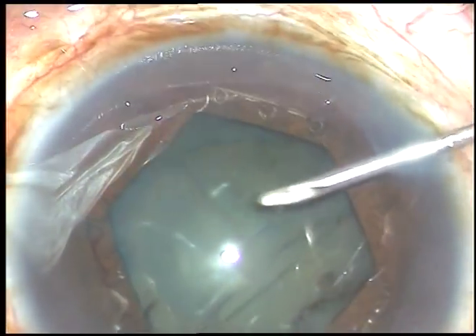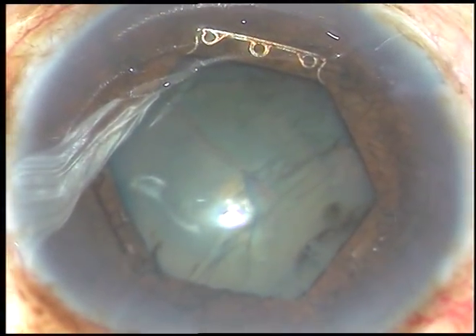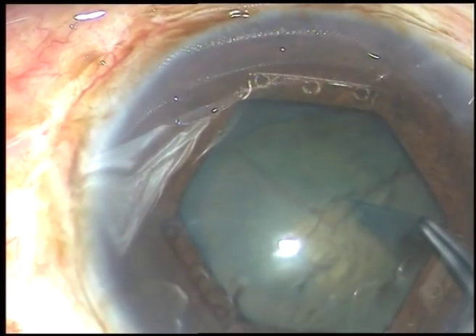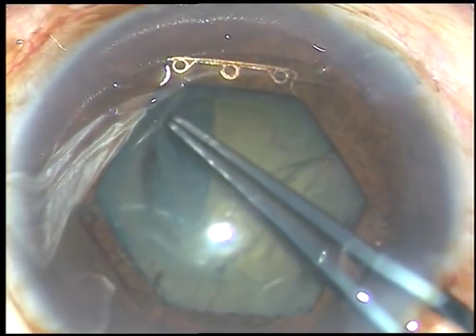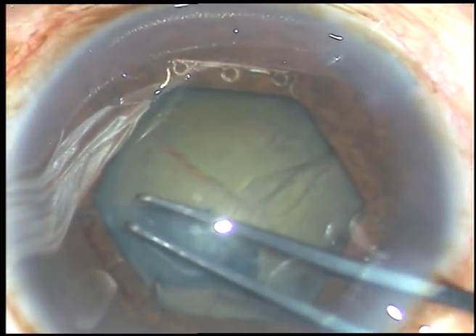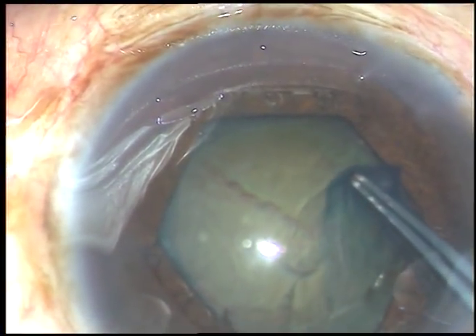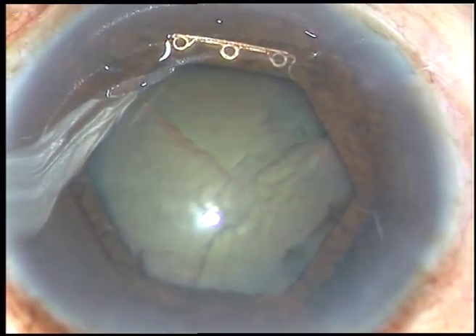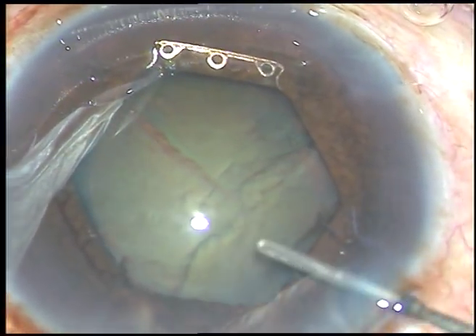See how easily and how quickly it has been tucked and the pupil has taken hexagonal shape. You will see after removal of this device the pupil is absolutely round — there is no damage to the sphincter pupillae. Now this is the capsulorhexis. I am using a Utrata forceps to do capsulorhexis and I am getting an adequately sized rhexis to manage this nucleus. The density of this nucleus is grade 3 or grade 3 plus, a little harder than grade 3 nuclear sclerosis.